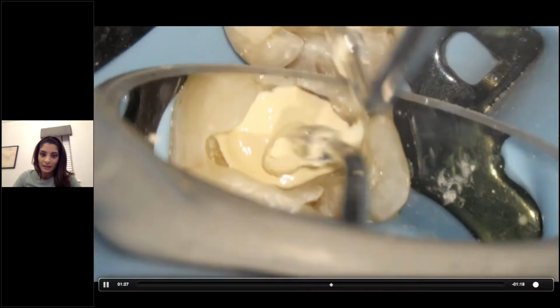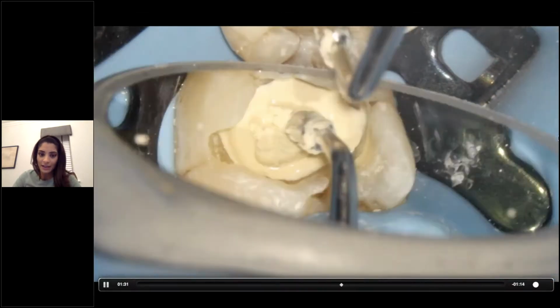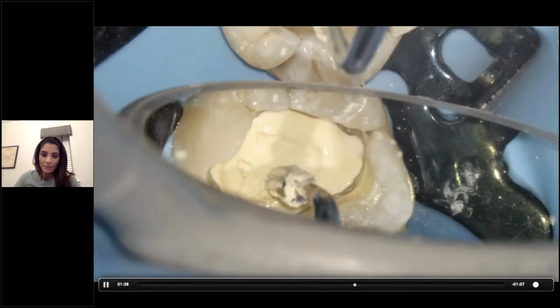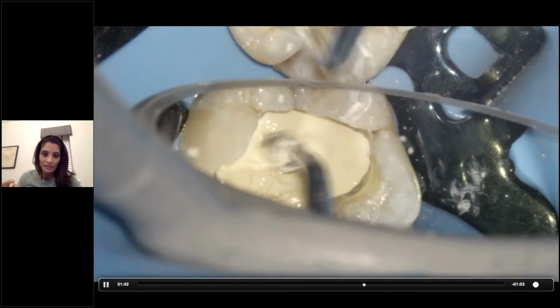So this is another little bit going in. I'm not packing it at this stage. I'm just gently pushing it just so it becomes one with the first layer of biodentine that's under it. You don't really want to pack biodentine like amalgam, for example. It's more of a gentle placement and push technique.